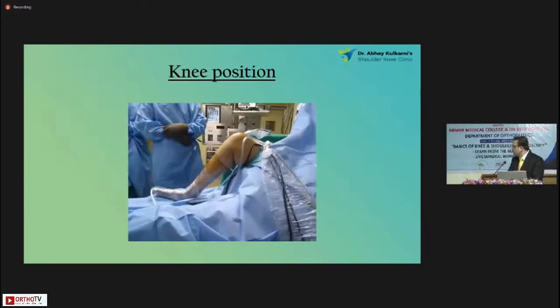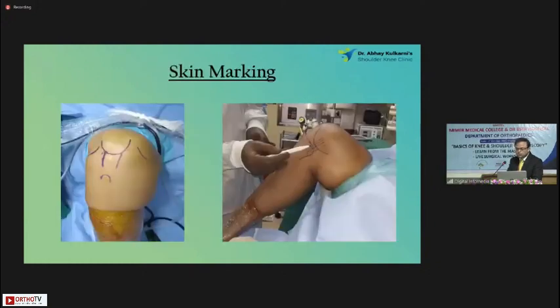This is how the painting and draping is done, this is how the knee will look. The first step before starting any basic knee arthroscopy is a good skin marking. One should do it for all cases — whatever you're doing, the skin marking is important.